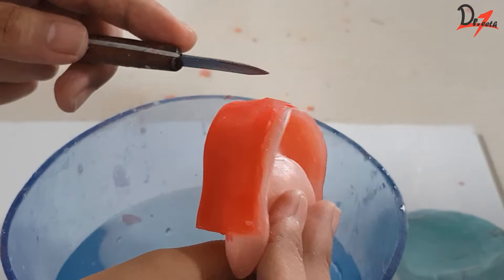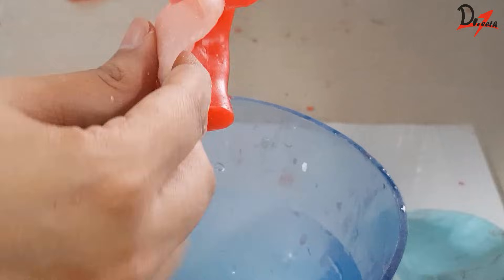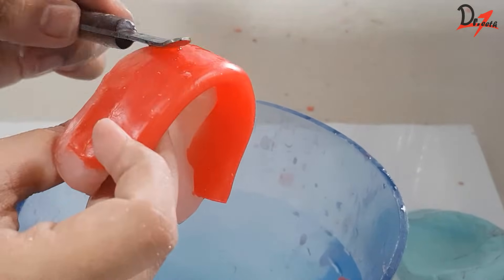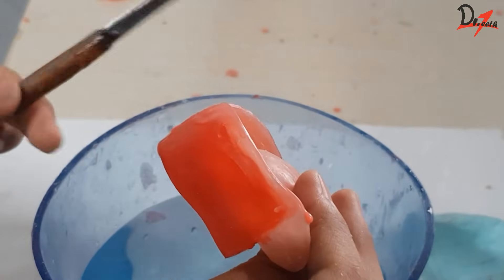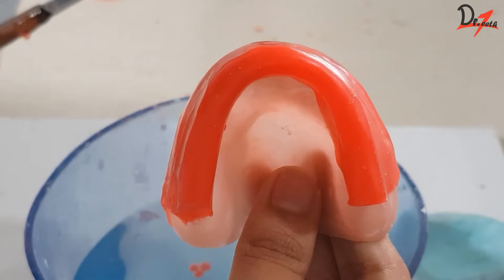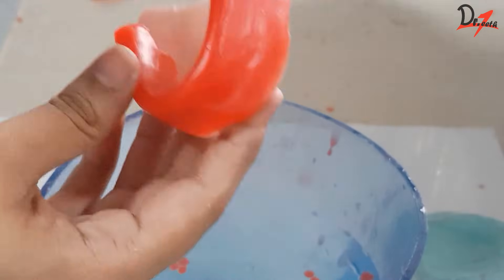Then I'm going to correct the proclination. We need a proclination of around 15 degrees, and to achieve that I'm going to remove the excess wax present near the flanges — just remove around the flanges, and this will give the proclination. Wax can be added or removed if required. The facial incisal edge of the maxillary occlusal rim in the central incisor area should be around 8 mm anterior to the center of the depression formed by the incisive papilla, so we can measure it using a vernier caliper. Now I'm sealing the palatal aspect of our rim.